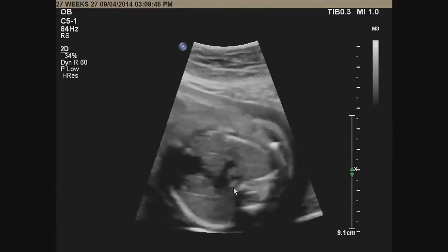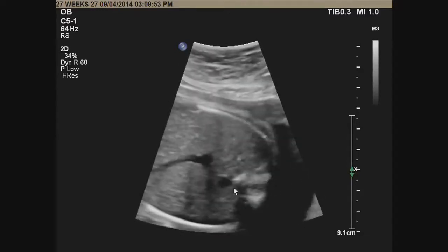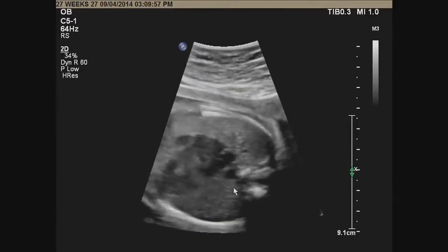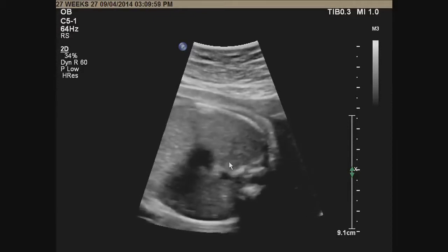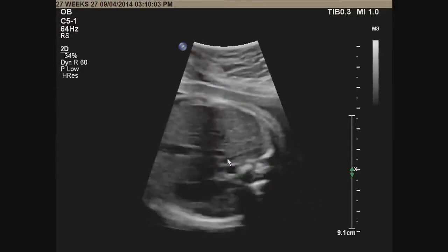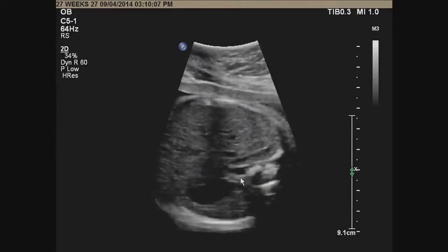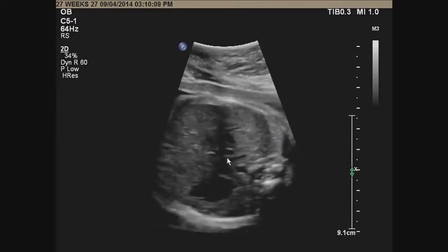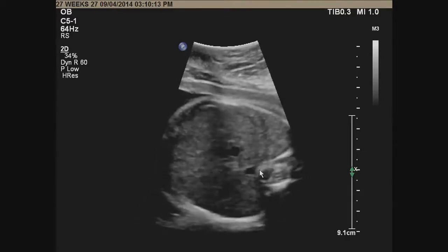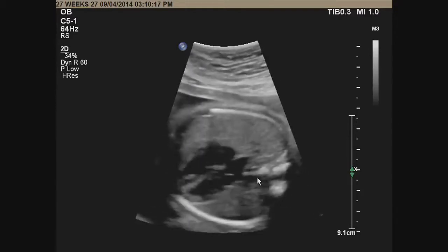The key is it has to be certainly smaller than the aorta. Normally, it's about 1/3 the size of the aorta. When you start seeing a large vessel sitting next to the aorta here, then you have to be very suspicious that there's an interruption of the inferior vena cava. Typically, the interruption is suprarenal. And then there is an azygous continuity, where the systemic venous system is coming up through the azygous vein and dumping into the superior vena cava, most commonly at the level of the heart.